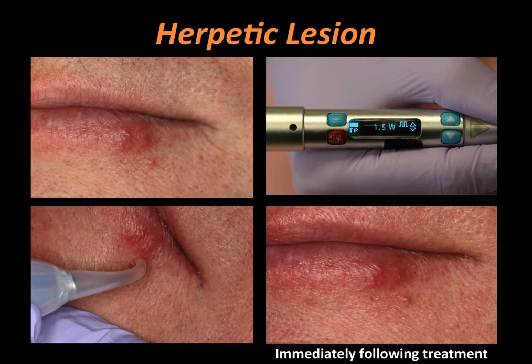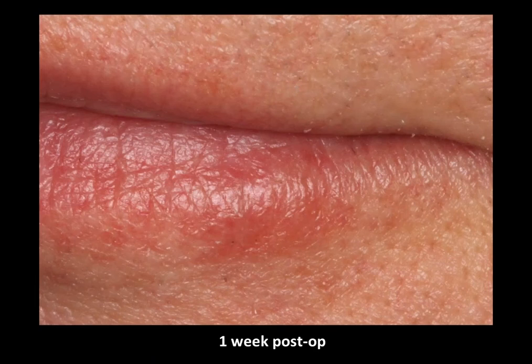And you can see we have the laser set with a non-initiated tip. We're not touching the lesion. Rather, we're getting close. And again, what the patient's going to feel is some tingly of the area. It's not painful, it's tingly. They'll almost describe it as feeling good in that area. So immediately postoperative and 1 week later, the lesion is completely gone and the patient did not experience the steps of a herpetic lesion of growing and growing and bursting. And they got an immediate response.